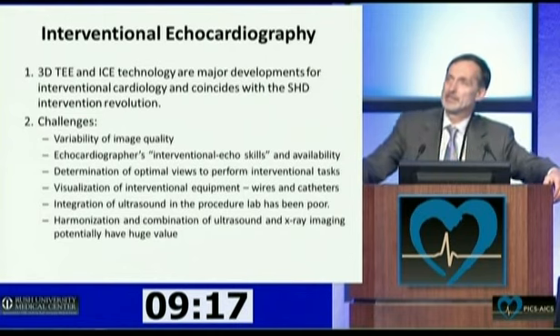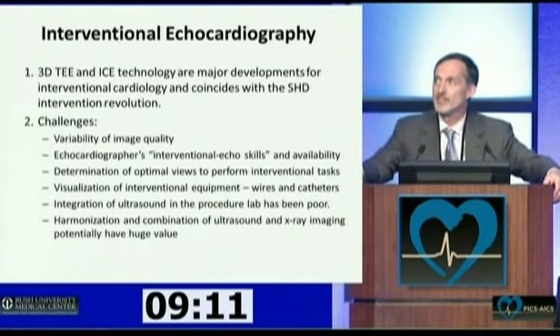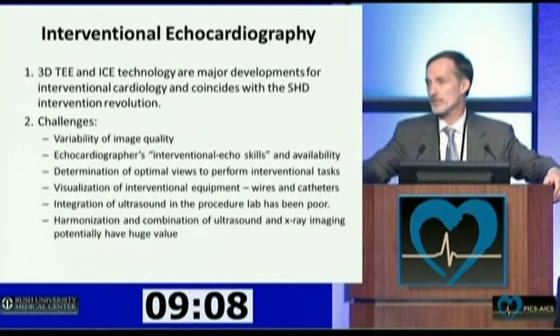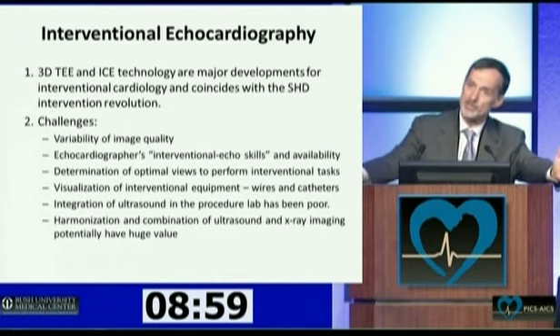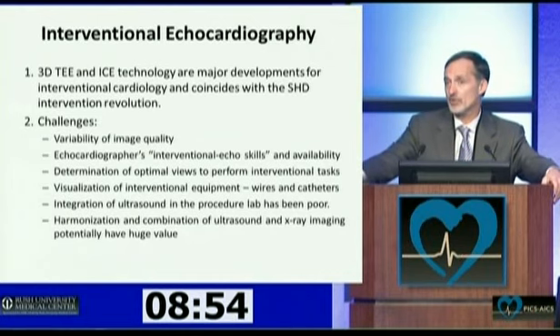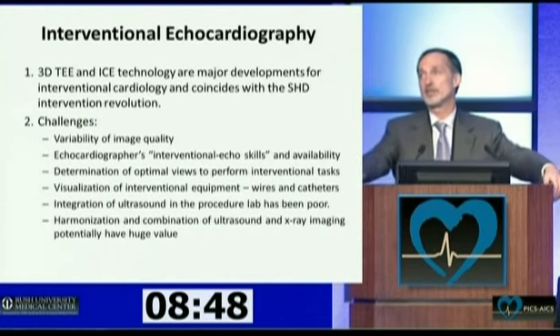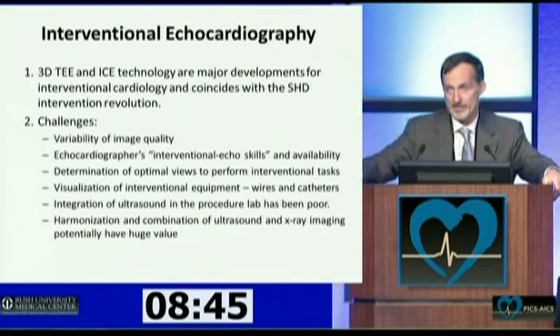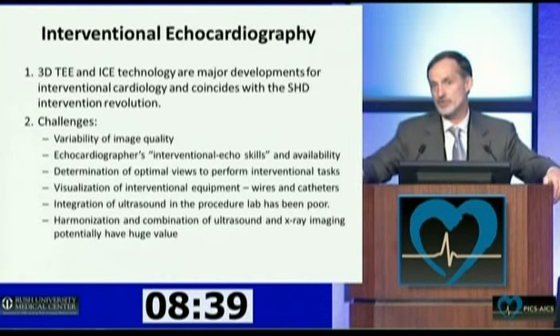We certainly have seen that the traditional views of a structure that are mainly diagnostically derived may not be the best for performing a task, and that we have to visualize more than anatomy, but wires and catheters, and sometimes ultrasound's good, sometimes it's not so good. And certainly there hasn't been integration heretofore of ultrasound. And when you think about a lot of these procedures that should be predominantly ultrasound guided and obviously reducing radiation dose profoundly, how would you redesign the procedure room for a predominantly ultrasound guided intervention?